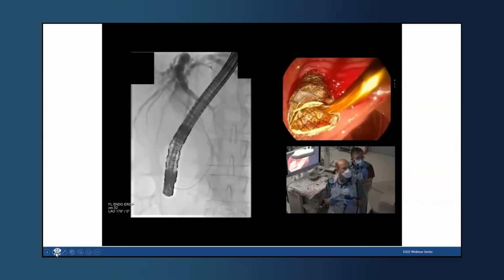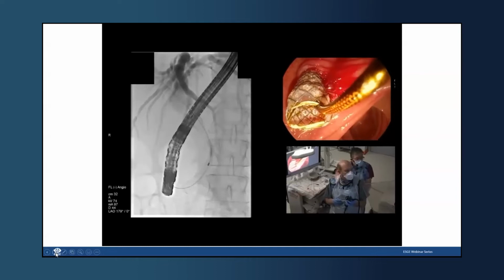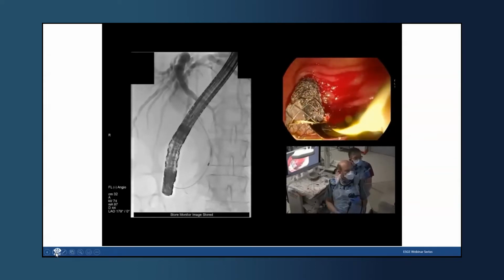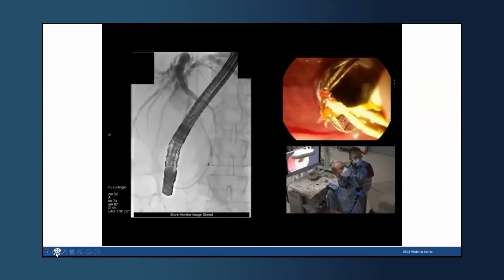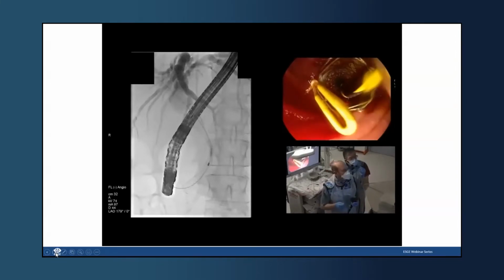Yeah. So that's perfect. Don't take your wire out until you're totally happy, but you are, aren't you? And lovely dark bile draining out. So that's a super procedure. Screen, please.